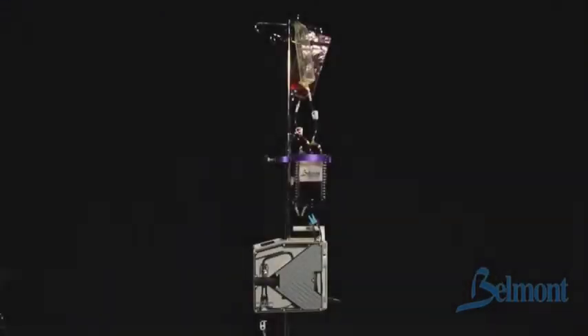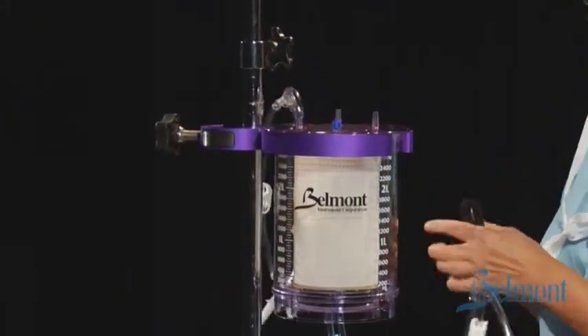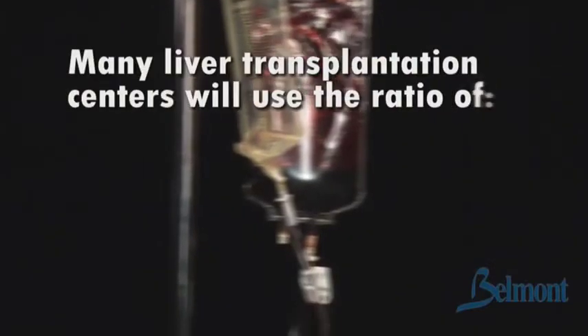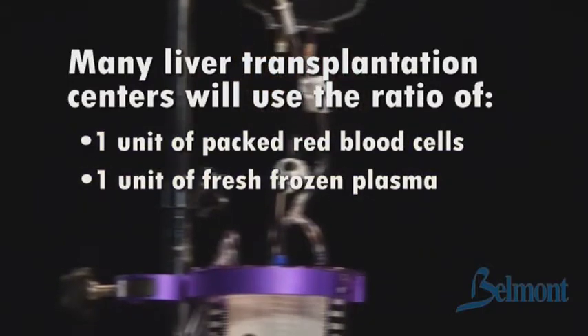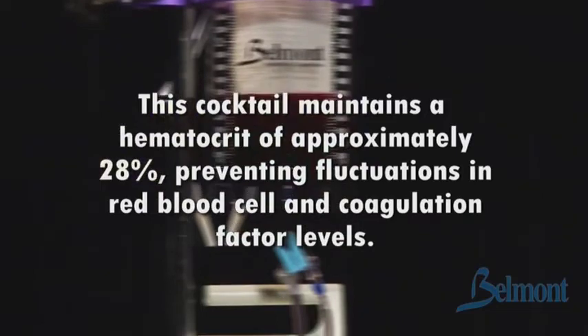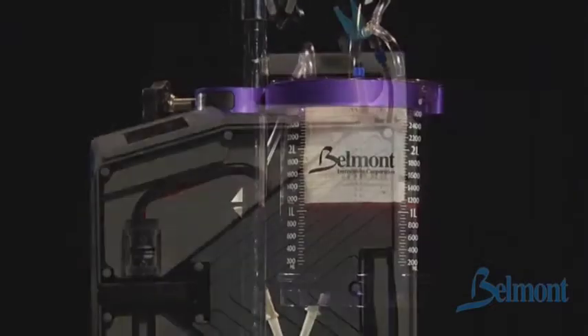An optional large volume reservoir can be added at the beginning of the procedure or at any time a larger volume reservoir is needed. It holds up to 3 liters of fluid and has 5 fluid spikes. The advantage of the large reservoir is it can be used to recreate whole blood providing a consistent fluid mixture. For instance, many liver transplantation centers will use the ratio of one unit of packed red blood cells to one unit of fresh frozen plasma to 250 milliliters of crystalloid solution. This cocktail maintains a hematocrit of approximately 28%, preventing fluctuation in red blood cell and coagulation factor levels. The reservoir can be added in less than one minute.